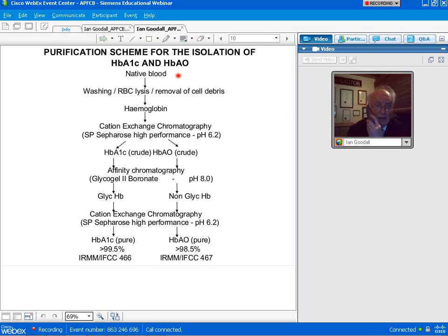Okay, the calibrators for the reference method: those two pure HbA0 and HbA1c are made into a calibration set of 6 calibrators, 0, 3, 6, 9, 12 and 15% hemoglobin A1C. And these are what the companies use to standardise all their assays.